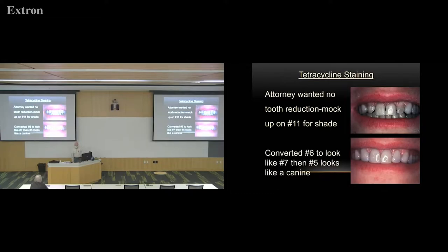Notice that tooth number six was in the lateral position — so we had to convert that to a lateral. Dental anatomy.